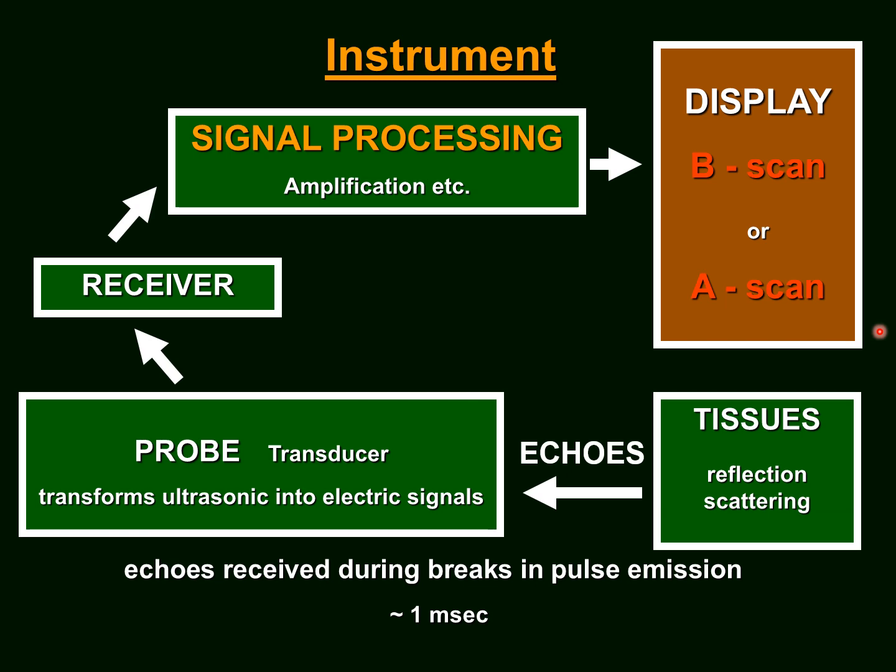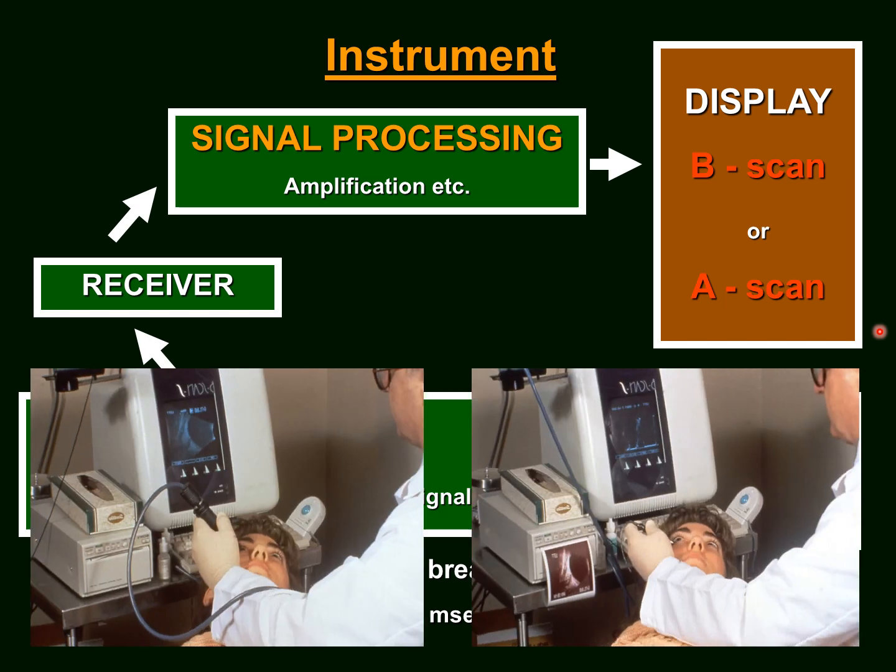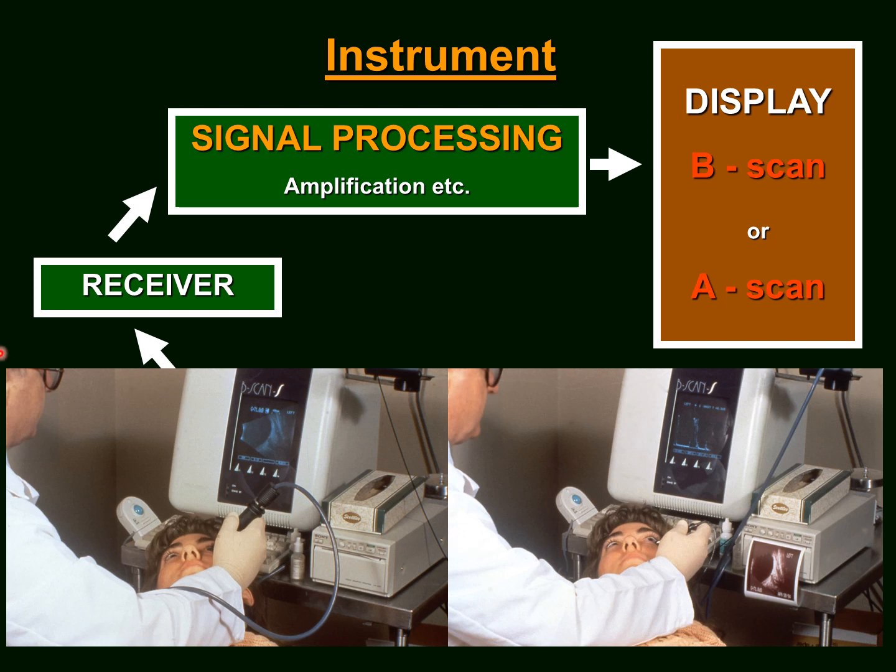And then we have on the same screen first the B scan, and then when we switch to A scan and switch the probes, the A scan.